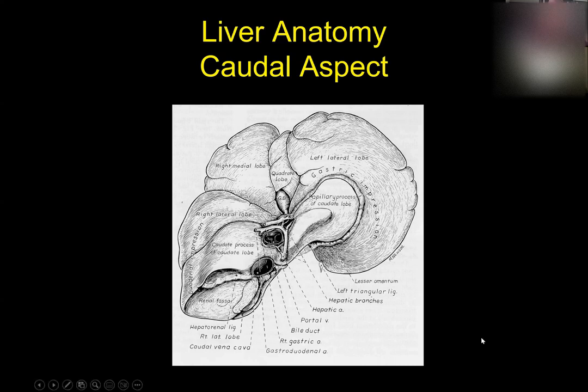Okay. That's the easy way to do it, and it works. The only lobe I would suggest that you keep in mind, and it's kind of cheating really, but it works, is the caudate lobe of the liver. It's on the right side of the dog, and it's the lobe that sits right in here. This says renal fossa right here. That's where the right kidney sits.